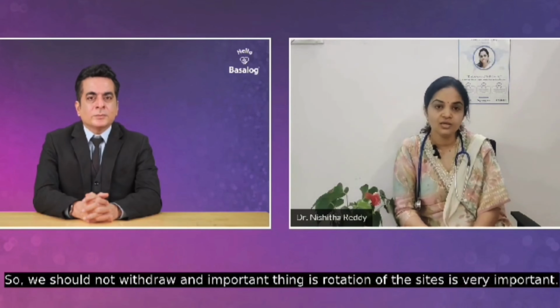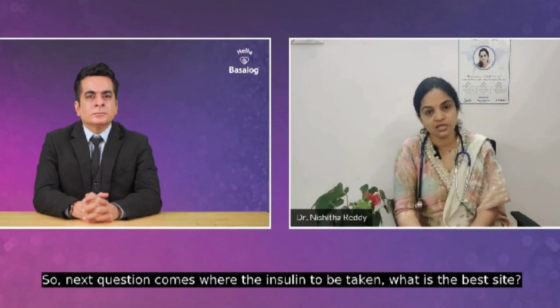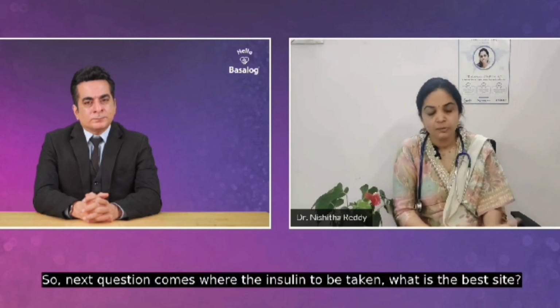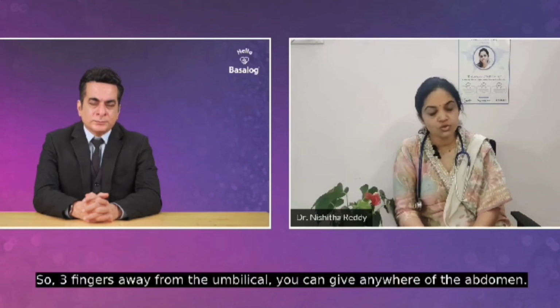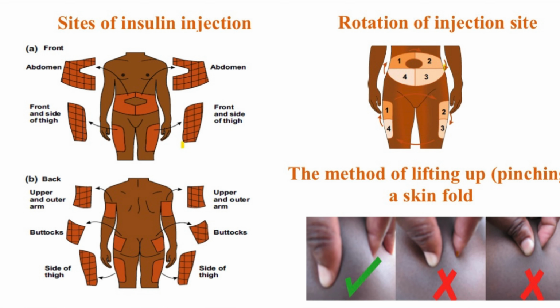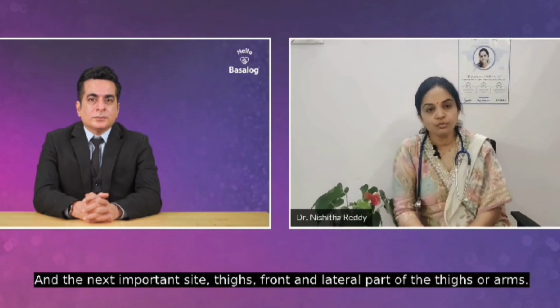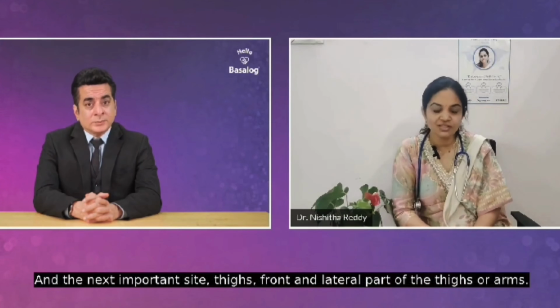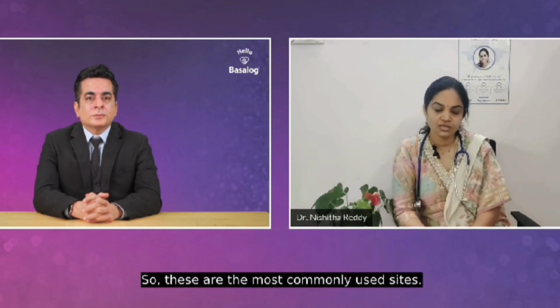And an important thing is rotation of the sites. The next question is, where should insulin be taken? What is the best site? The best site for good insulin absorption is the abdomen. You can inject anywhere on the abdomen, 3 fingers away from the umbilicus. But site rotation is very important. At least a 1 centimeter gap should be there from the previous site. The next important site is the thighs, the front and lateral part of the thighs, or the arm. These are the most commonly used sites.